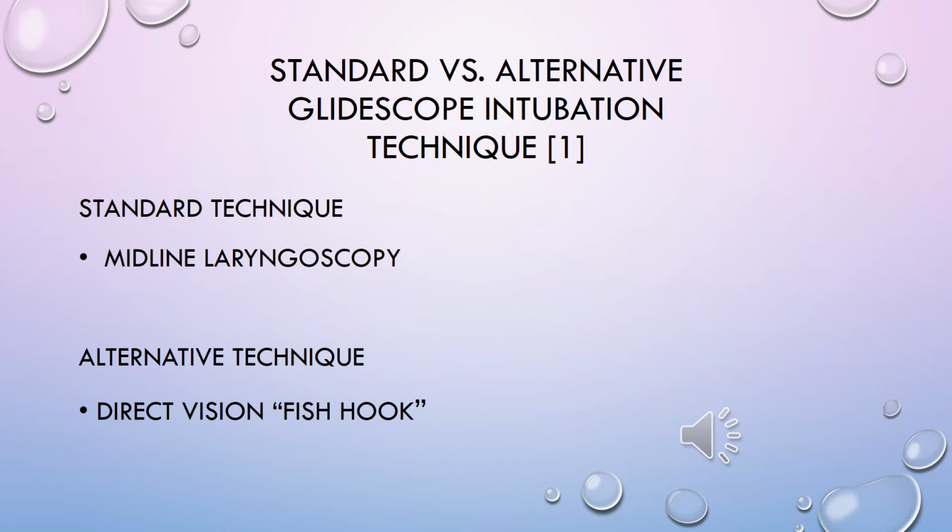There are several advantages to the alternative technique. The first advantage is that the technique of the ETT insertion would minimize the laryngoscopy time, as a part of it is performed before the blade is introduced and the stimulating effect occurs. This technique thus has the potential of reducing the sympathetic response as well. Minimizing the oral pharyngeal laryngeal stimulation time would theoretically attenuate the hemodynamic response.